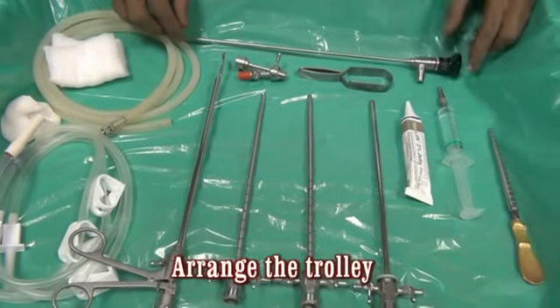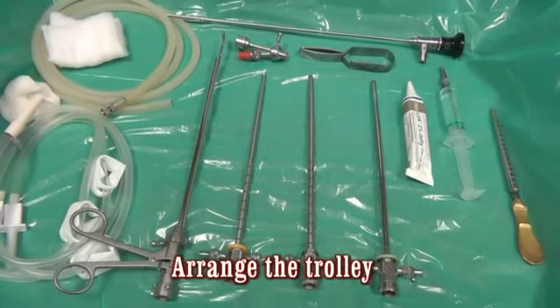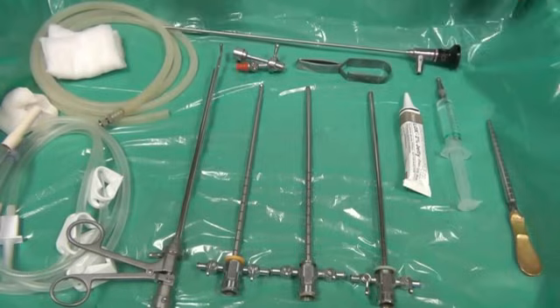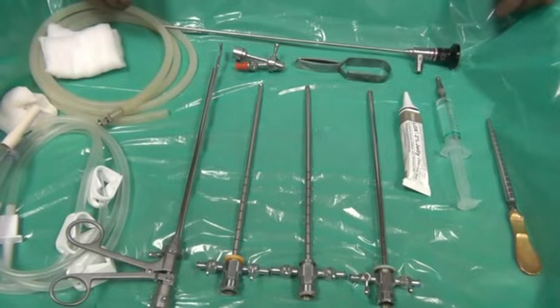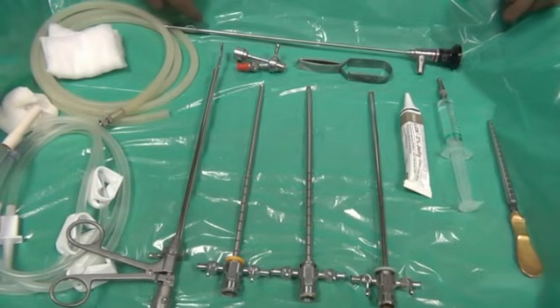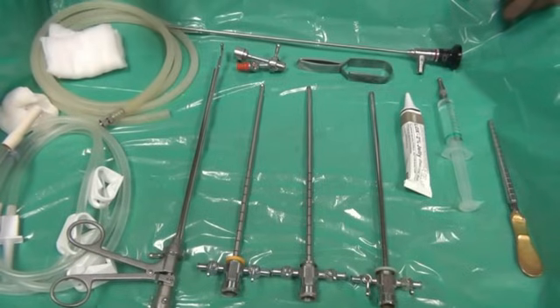Sometimes you need to examine the anterior part of the bladder — the anterior wall just close to the bladder neck — and for that purpose you may need to use a 70 degree lens. But in this video I will show you how to examine that part of the bladder with a 30 degree lens only, so you need not have so many lenses in your armamentarium.